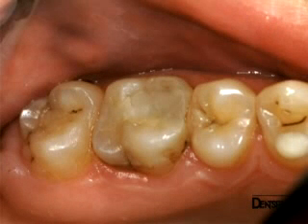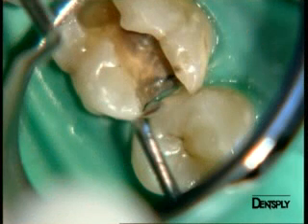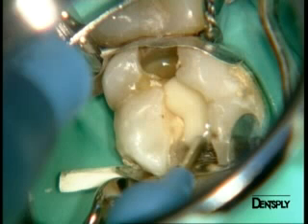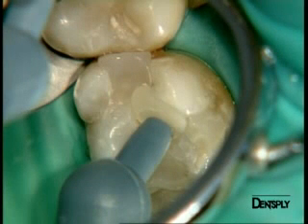To conclude, we have seen how easy it is to use the flowable composite X-Flow in three totally different clinical situations. In the pre-molar, we experienced the ease of insertion of X-Flow into a distal cavity without opening the marginal crest. In the second molar, we were able to apply the flowable material X-Flow directly into a small cavity with a very small opening without risking the inclusion of air bubbles. Finally, in the first molar, we used X-Flow as a liner at the bottom of the cavity. In all cases, we obtain total satisfaction with the quality of the restorations realized with the two materials X-Flow and Quicksfill.